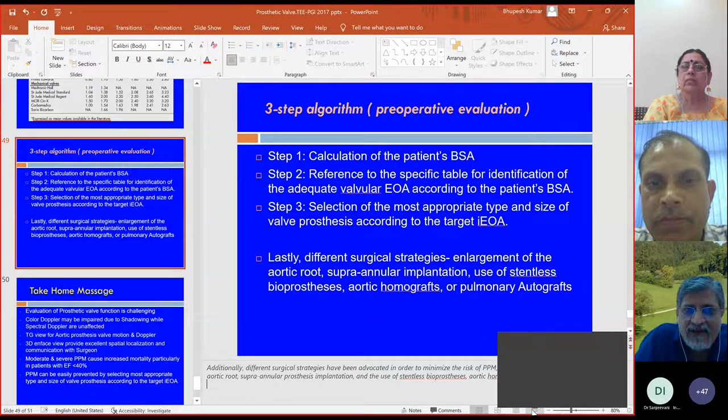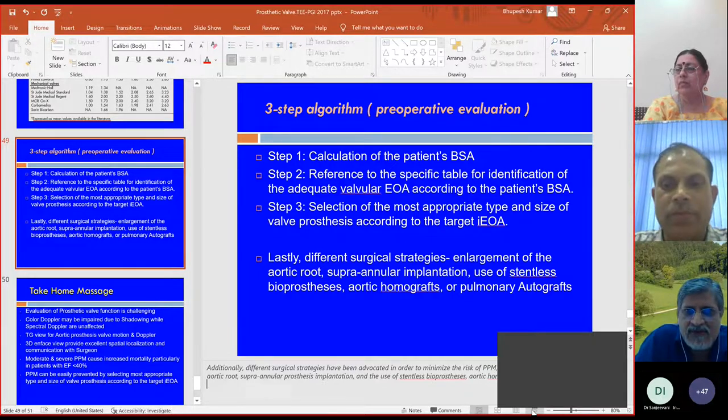Then if you go to the two-chamber view, if you get it next to the LA appendage, it is at 10 o'clock. Opposite side is at 4 o'clock. Then if you go to the commissural view, next to the P1 side, it will be at 9 o'clock approximately, and the other side at 3 o'clock, plus minus 1. And then in the four-chamber view, it will be around 8 o'clock, and the opposite side around 2 o'clock, plus minus 1. That's our usual location.